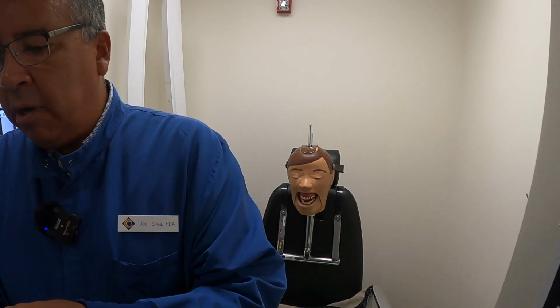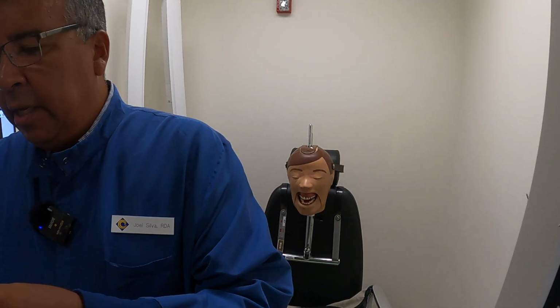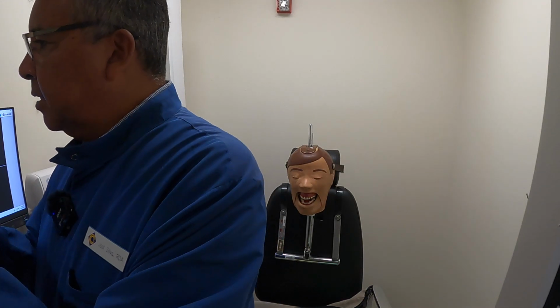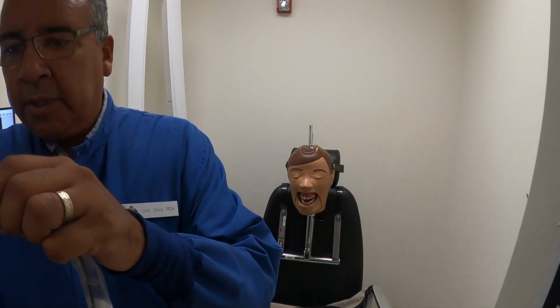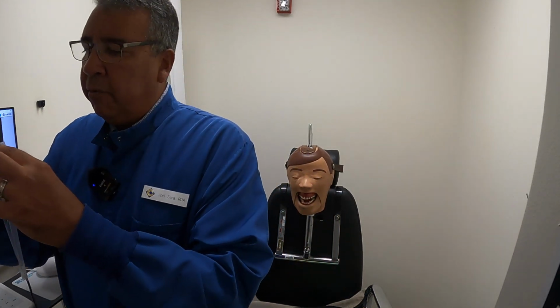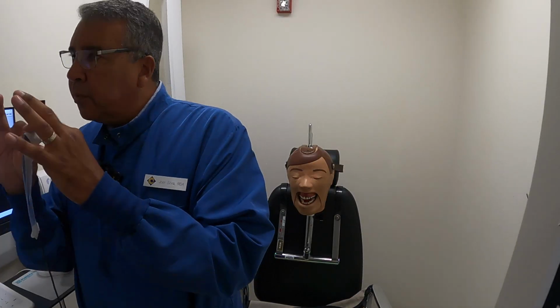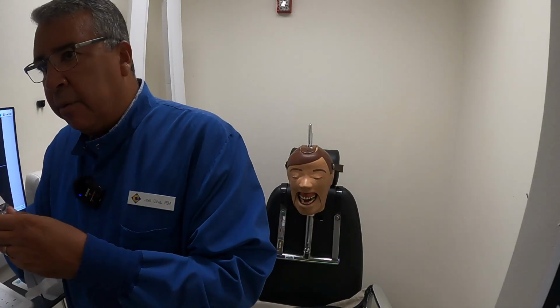So I'm going to take this off and then wrap it on the other side. That tab should actually be on the plain side, and then I'm going to bring it over here and pinch it to the best of my ability down the center as possible. So I have an equal amount on top and an equal amount on the bottom, okay? I will tell you that this cord or this styrofoam bite wing tab, as you start to use it, will start to move. Even from when you do your premolar to your molar, it'll stretch and do crazy things, and you'll have to readjust, or you'll get what's called inadequate margin problems.